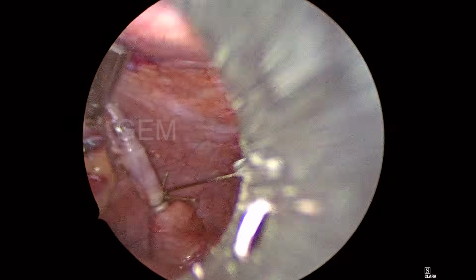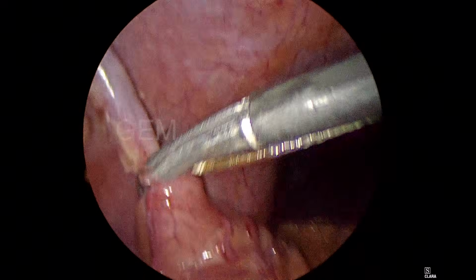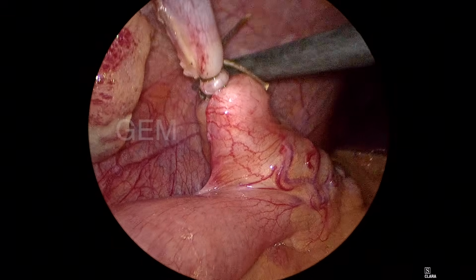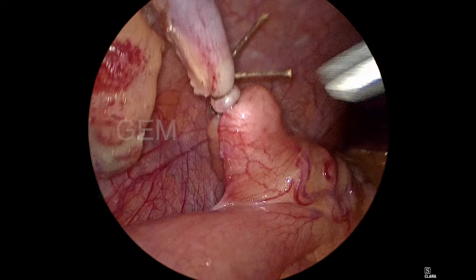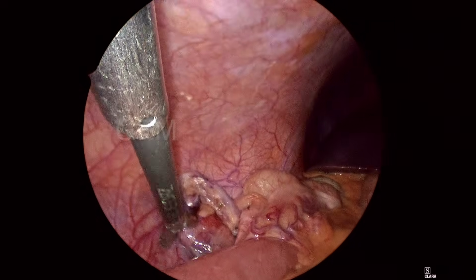And we have a study that provides supportive evidence that we can apply a Hem-o-lok clip to the base of the appendix and then divide. So I'm just checking the distance. You can see the 5 mm instrument is so big, and the distance between the two loops is so small. It is a 1 to 2 mm distance.